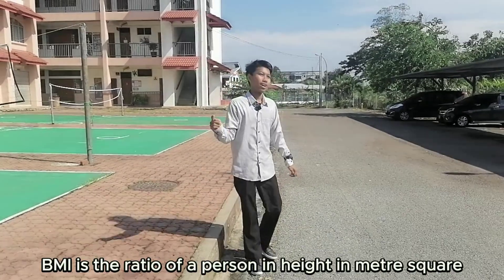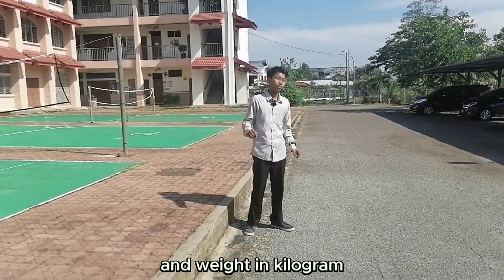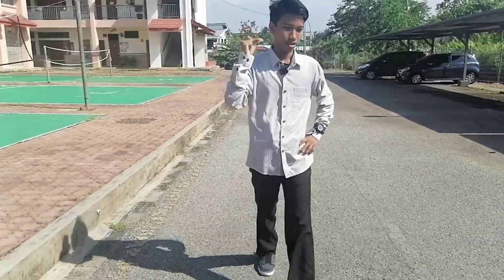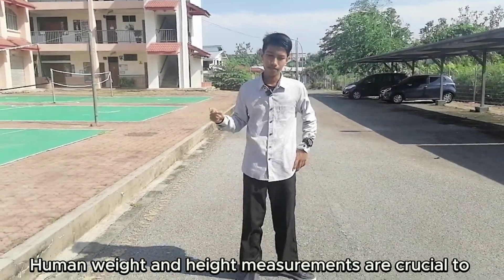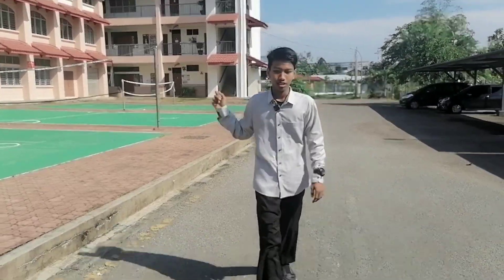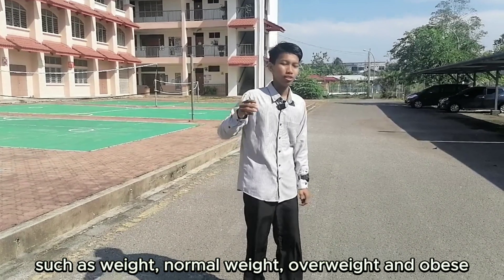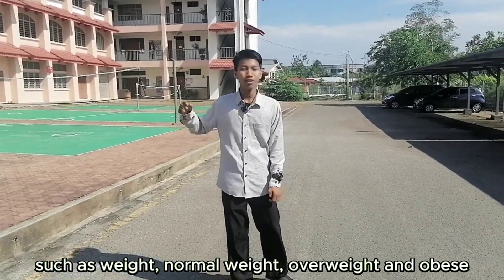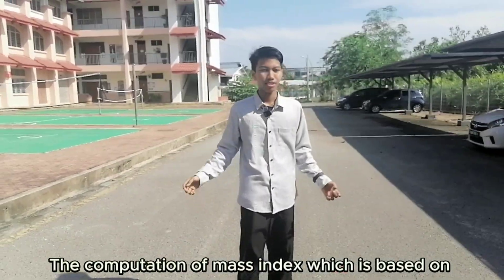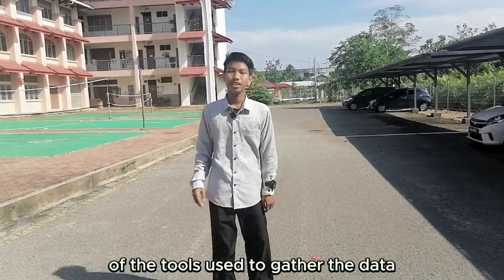I got it. BMI is the ratio of a person's height in meters squared and weight in kilograms. Human weight and height measurement are crucial to determine how healthy they are. One more thing — to determine the status of the body such as underweight, normal weight, overweight, and obese. The computation of mass index, which is based on measurement of height and weight, is one of the tools to gather the data.